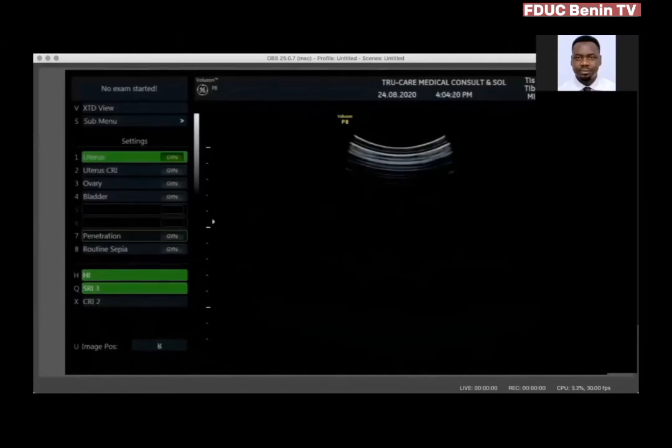So I have my video back on now. I have a client here who is allowing me to scan. She's 32 weeks pregnant, and she's actually carrying twins. So we're going to try to see if we can get any body part. The main thing is just to see whether we can show her any part of the body.